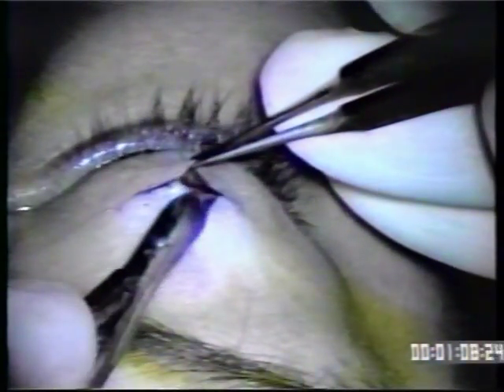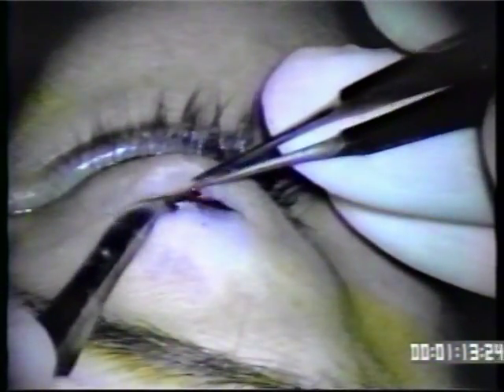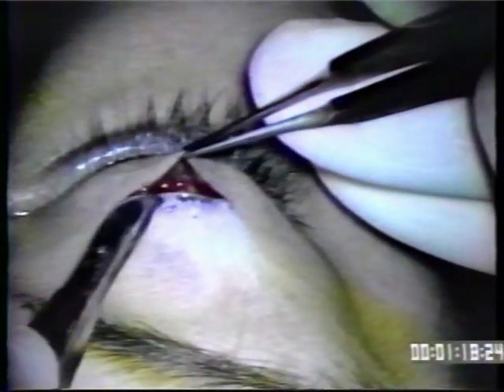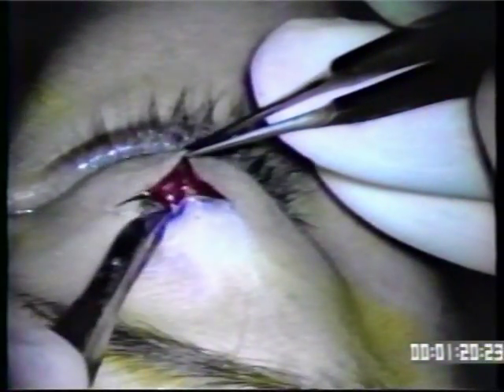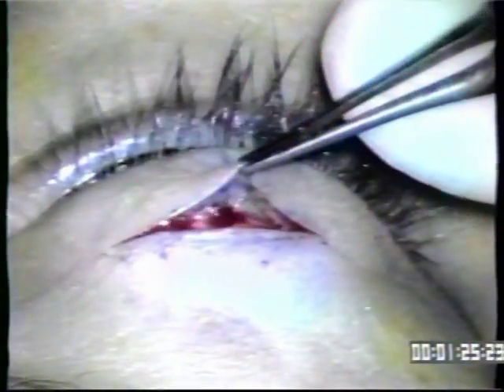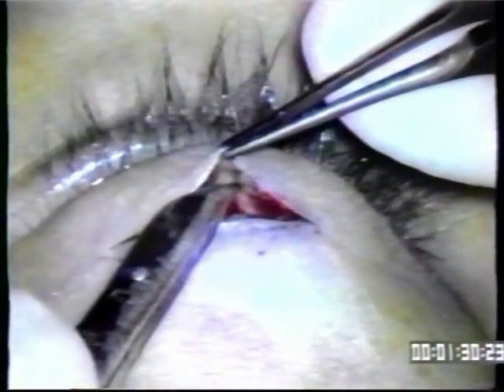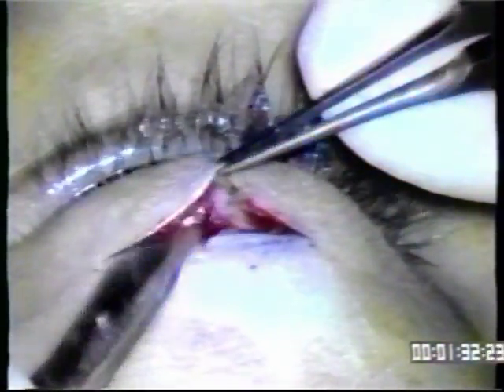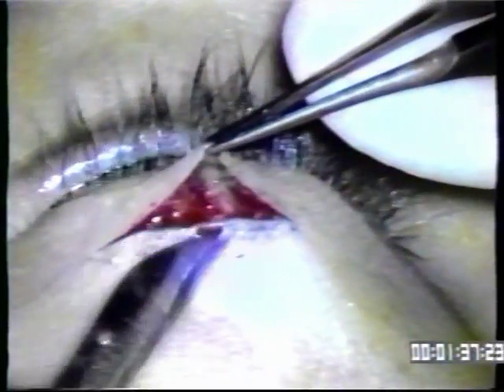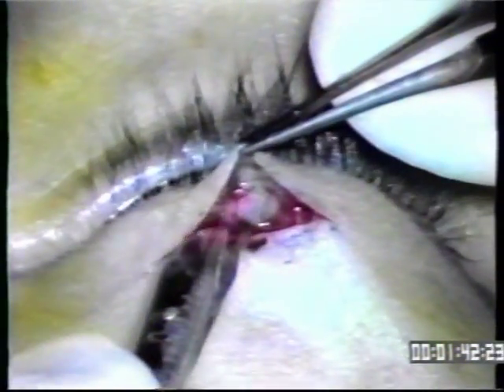Using double-action scissors, we enlarge the incision through skin and subcutaneous tissue. If there is muscle, we go through the orbicularis oculi muscle, which is very thin. The next structure will be the levator aponeurosis, which attaches to the tarsus. Grabbing the lower skin margin, we see the skin, subcutaneous tissue, and the levator aponeurosis. Putting the scissors in open and pushing down to the tarsus, then closing, will take you right to the tarsus.